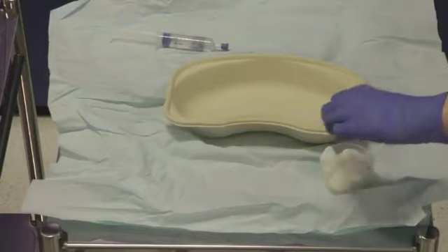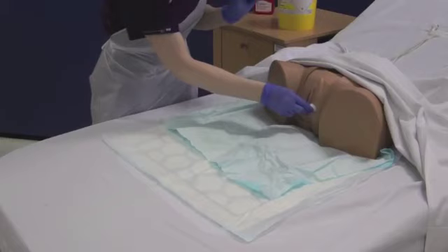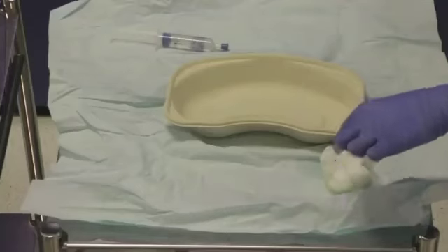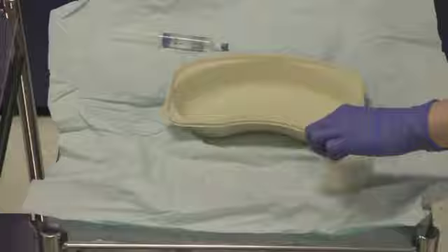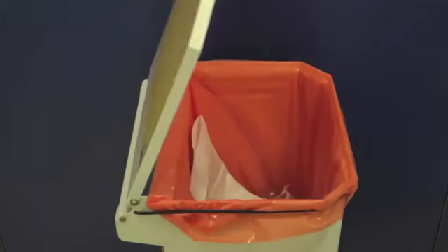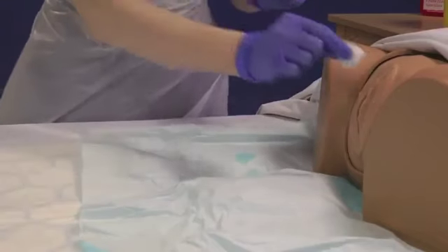It may be necessary to part the labia at this point using the sterile swabs. UHL policy utilises a clean hand, dirty hand technique as demonstrated here. Use your clean hand to pick up the sterile cotton wool balls and pass them to your dirty hand. This ensures that your sterile field is not contaminated. The dirty hand is the only hand that touches the genitalia.